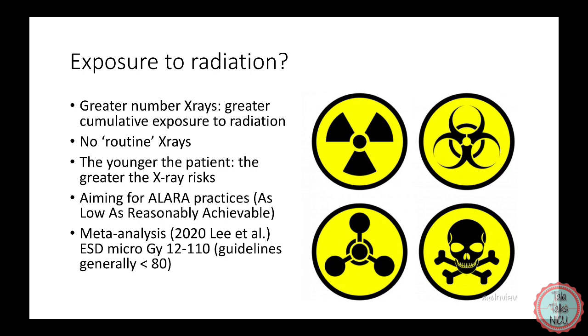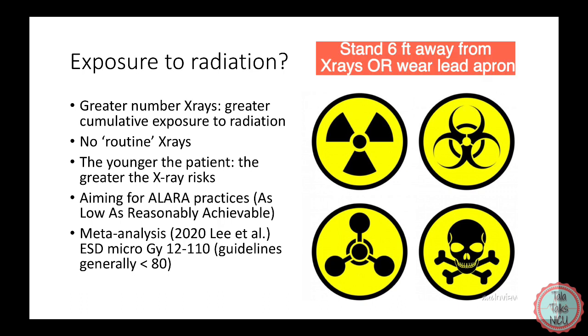But just one more thing I want to add about radiation, and this is directed at everyone in the unit. Often these babies need to be held a certain way, and we often end up standing near the babies while the X-rays are being taken. All of this ionizing radiation adds up, so always stand at least 6 feet away, especially if you could be in your first trimester of pregnancy.